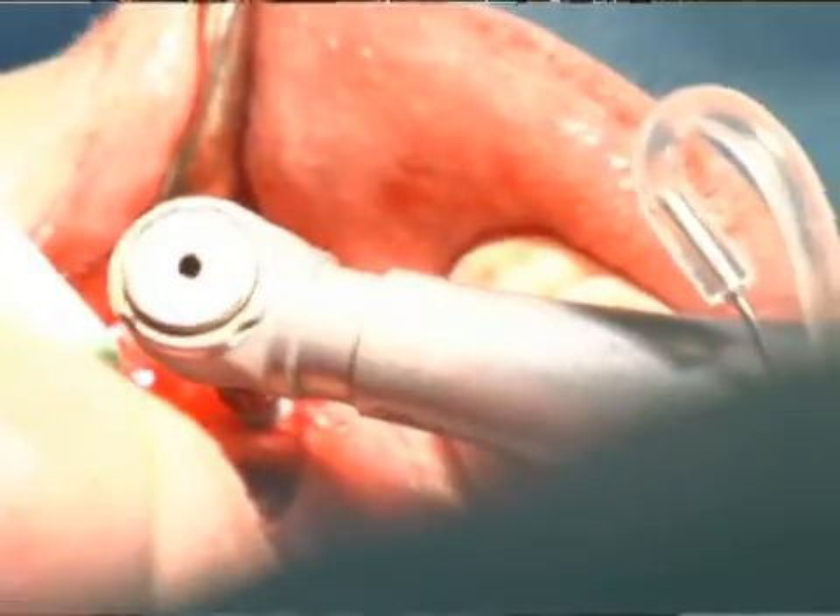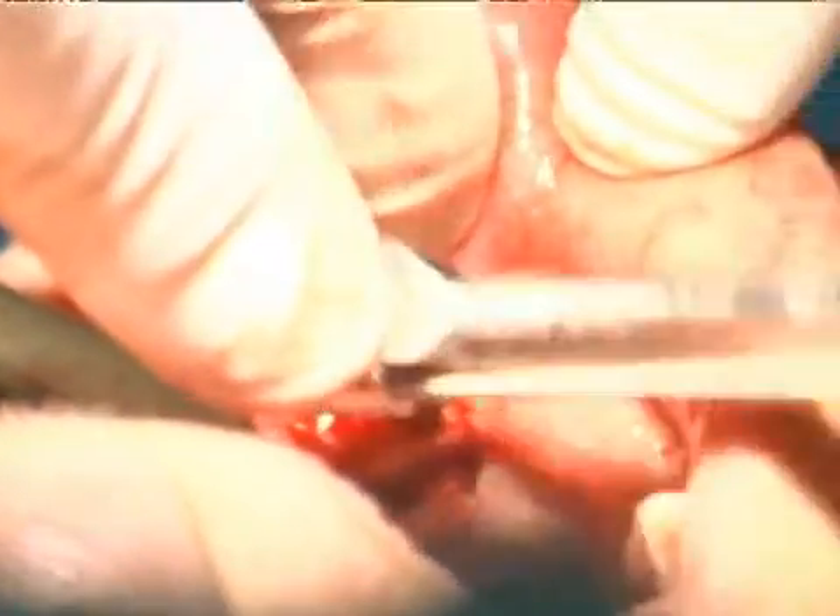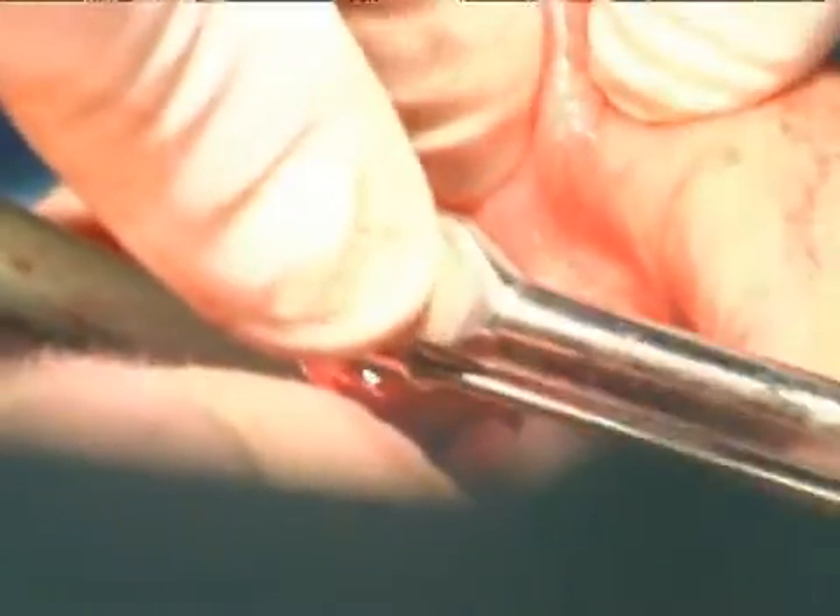we have a little torque wrench that we kind of go click, click, click until the implant is flush with the bone.